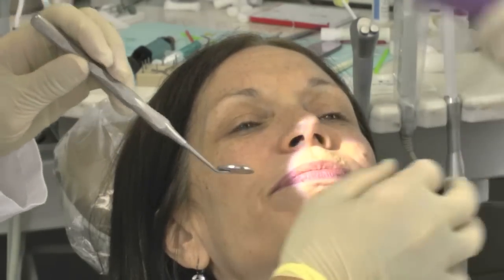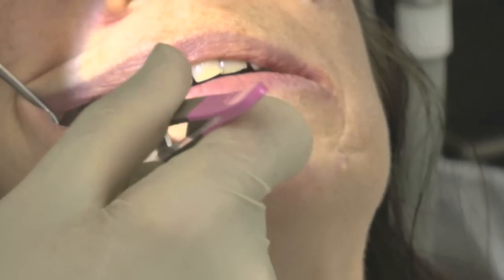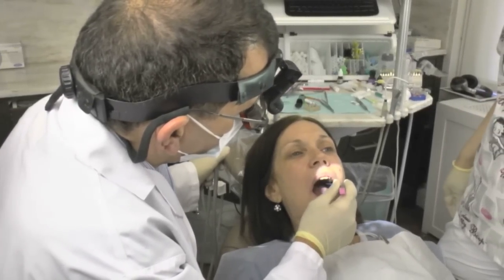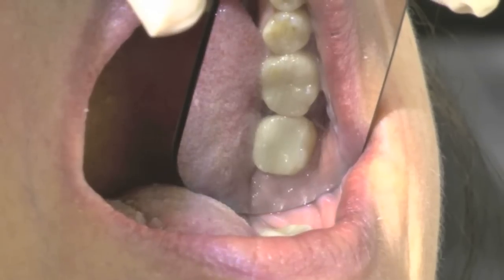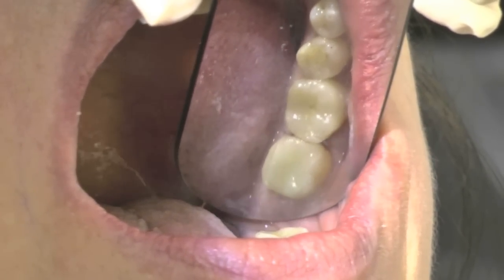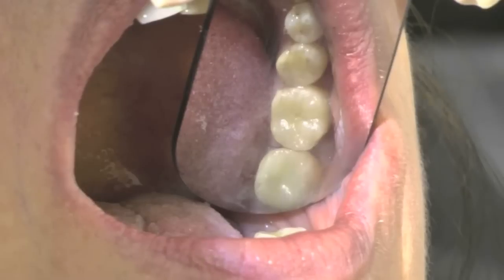CAD CAM technology, and E4D in particular, has allowed us to achieve an incredible result in just about 2 hours. It's great dentistry. It's wonderful for practice efficiency and productivity. But most importantly, patients are thrilled.